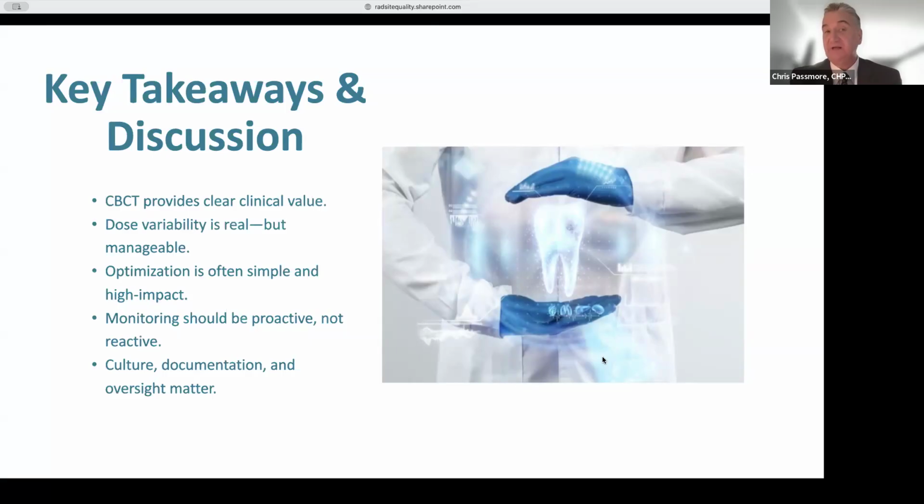I would also say something that we haven't really discussed here: we all get dental X-rays, right? And I've seen some crazy stuff where they've rigged their exposure buttons so they're not really behind the shield. They've defeated the shield and they're in the room with you, or they have a gun and they're shooting it across at themselves. Just crazy things like that. Just keep in mind time, distance, shielding, and keep your head about what you're doing in the field.